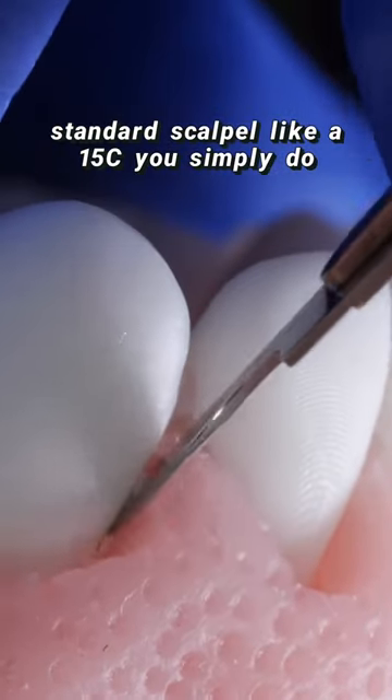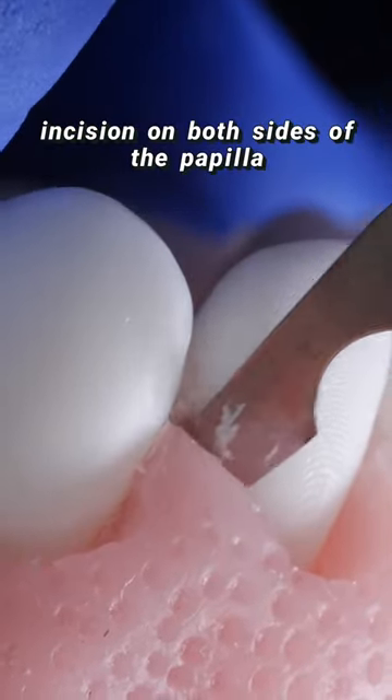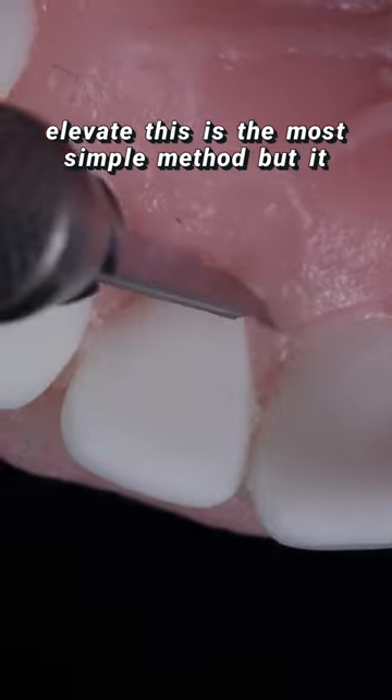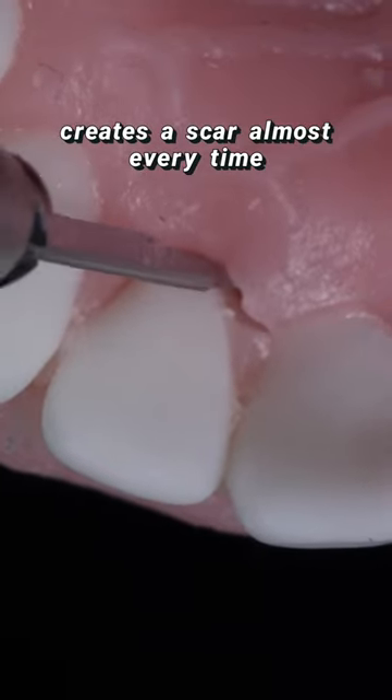If you're using a standard scalpel like a 15C, you simply do an incision on both sides of the papilla, cut across it, and use something like a Buser elevator to elevate. This is the most simple method, but it creates a scar almost every time.